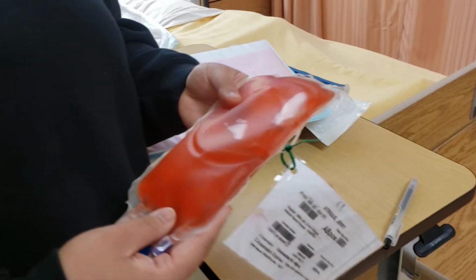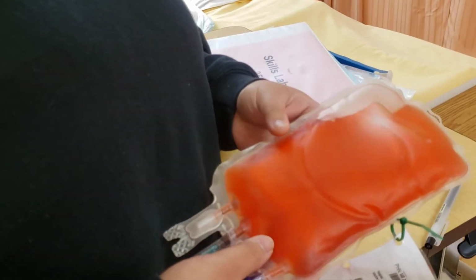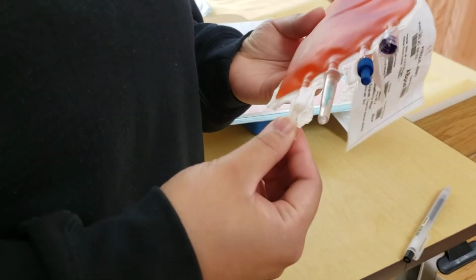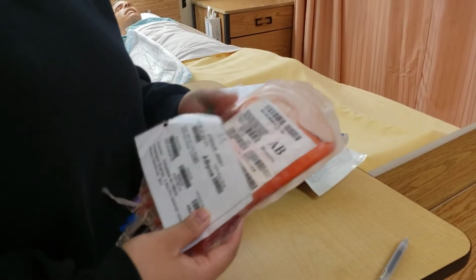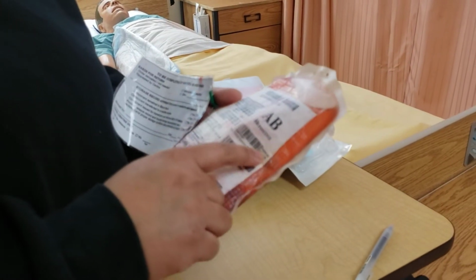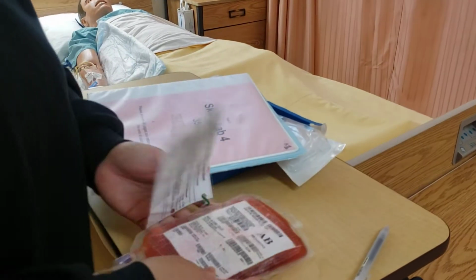And then I'll also physically inspect the bag for any discoloration, if there's blood clots that's present. And then I'll be checking the integrity of the bag, making sure that everything is intact. And then I'm also going to check the expiry date on the bag, as well as the volume that's on the bag.